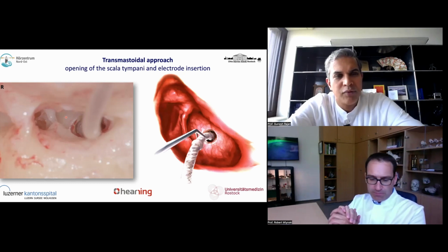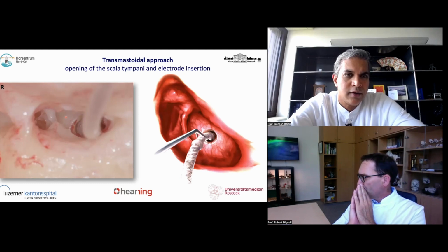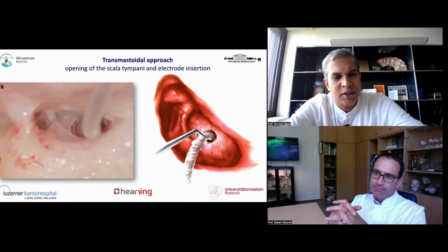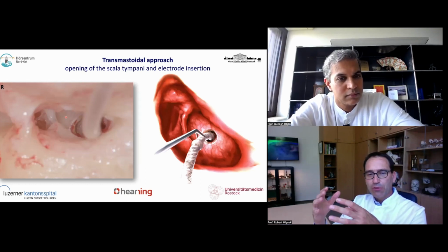Usually, I've seen quite a few surgeons say that the electrode seals off the round window niche, the opening, so it's tight. That's probably also one point. I think there are some ongoing studies looking at whether the infection rate is higher, but it doesn't appear to be, which is quite interesting. I don't think it's a big issue. But we always have to be consistent in our argumentation.